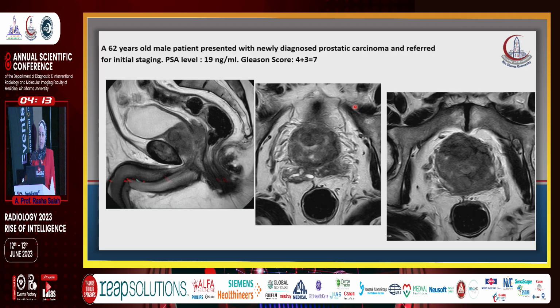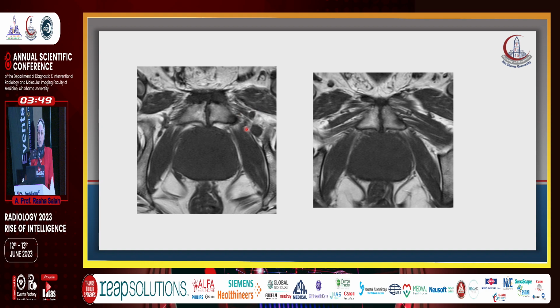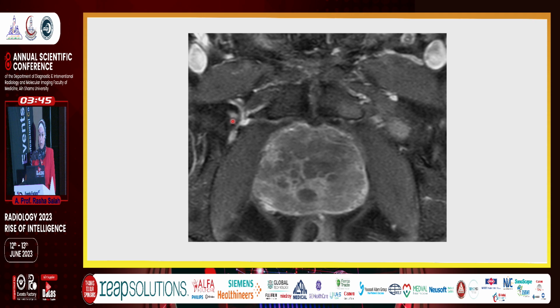This patient has this huge prostatic infiltrative lesion on this MRI study, infiltrating the seminal vesicle, and these are the nodal metastases. This was just a multiparametric MRI. With the multiparametric MRI, we discovered this small suspicious osseous metastatic lesion, and we asked for PSMA evaluation. This is the T1 weighted image showing this osseous lesion at the left pubic bone. And this is the post-contrast image showing enhancement in this osseous lesion.